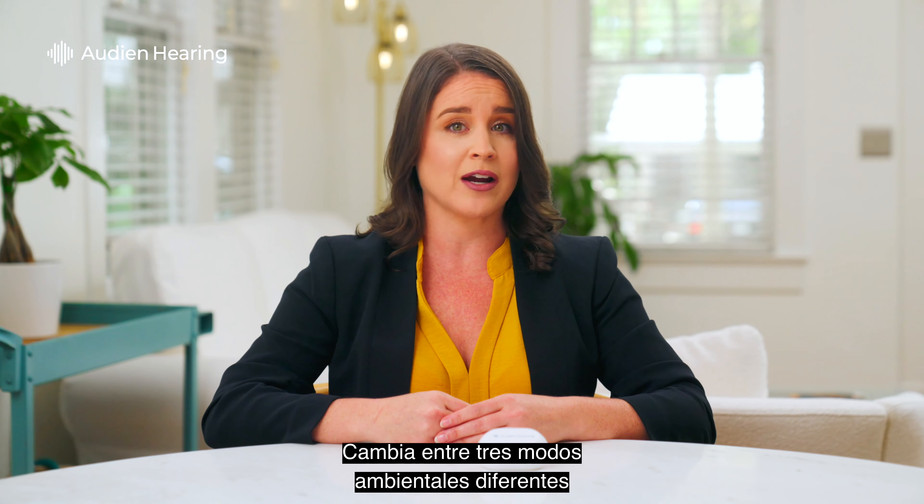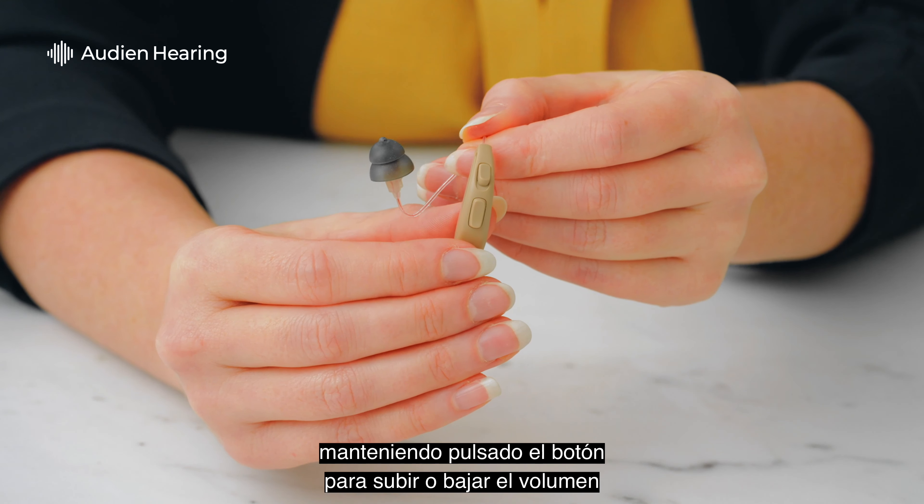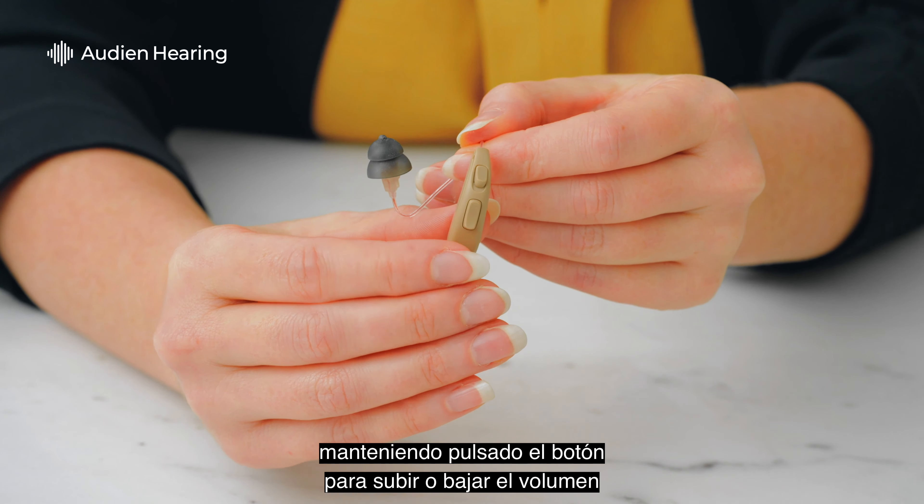Switch between three different environmental modes by holding the volume up or down button until you hear a chime. The number of chimes you hear after the three second hold indicates the selected mode.